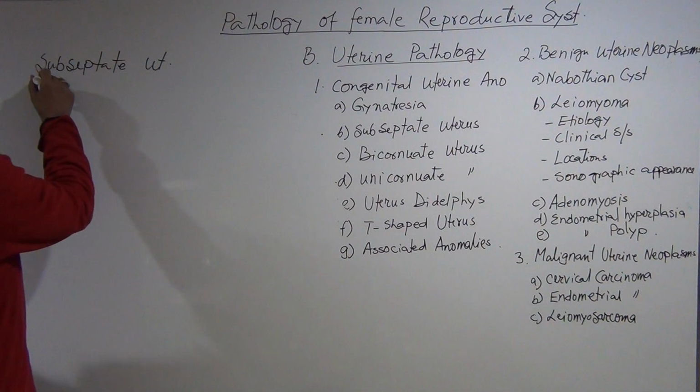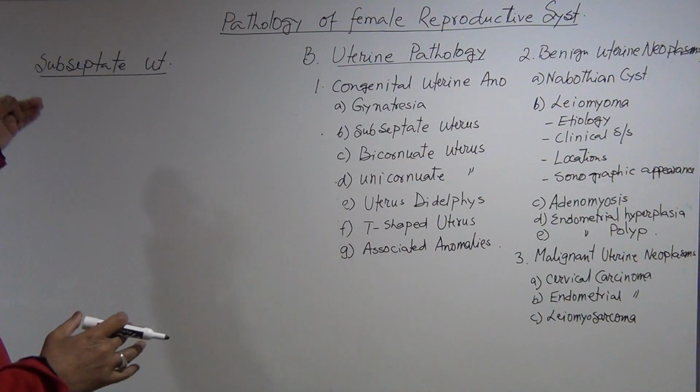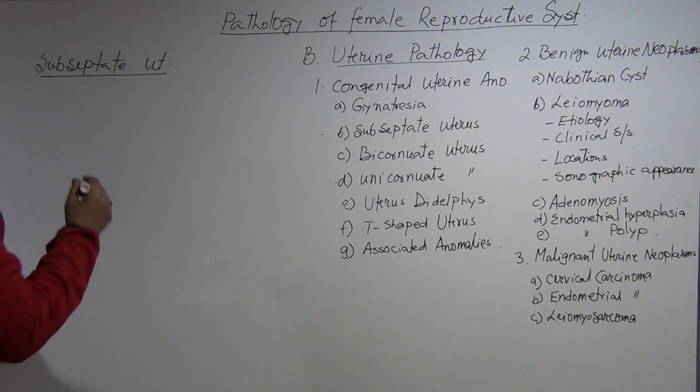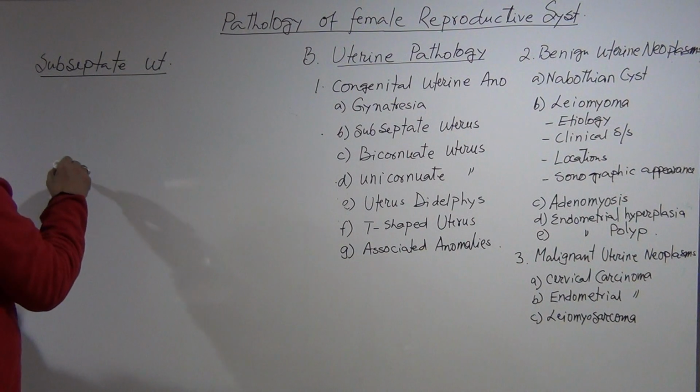Subseptate uterus means it's not completely septated, subseptate. So now let me give you the anatomy of this.